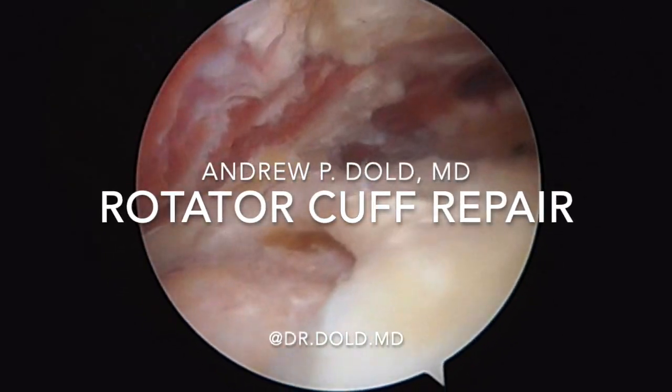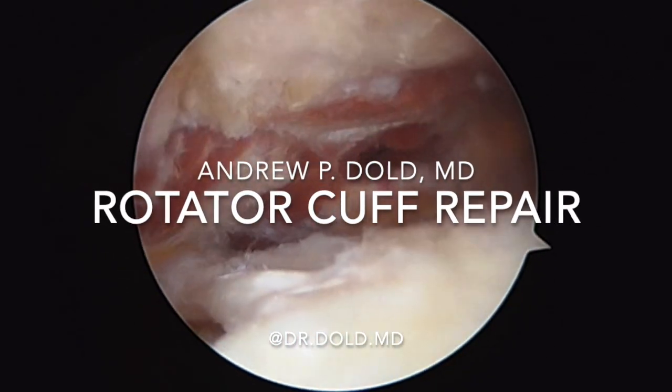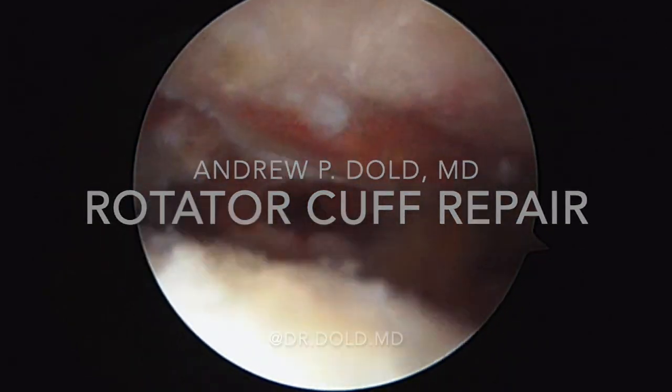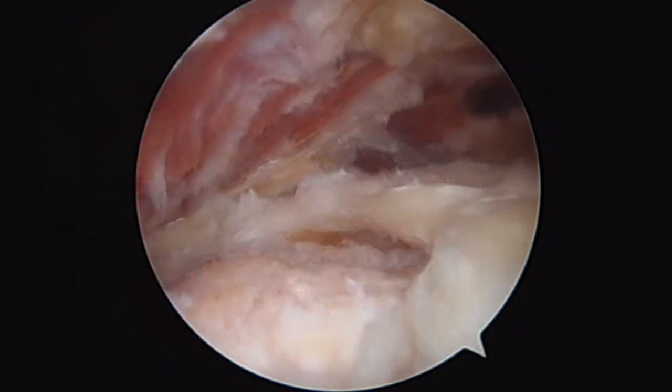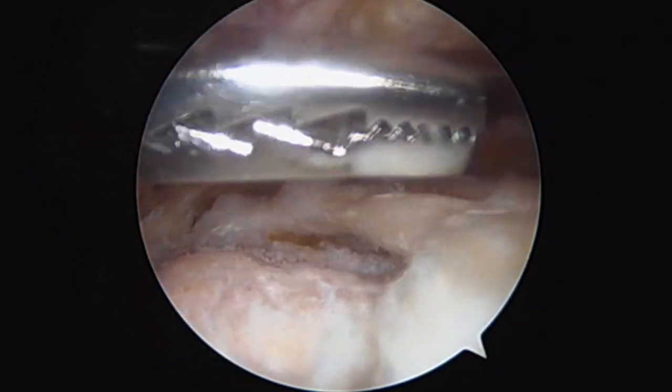Alright guys, we're in this patient's left shoulder. This is a 50-year-old guy with a rotator cuff tear. We've already done subacromial decompression here. This is the supraspinatus, and this is what a rotator cuff tear looks like.